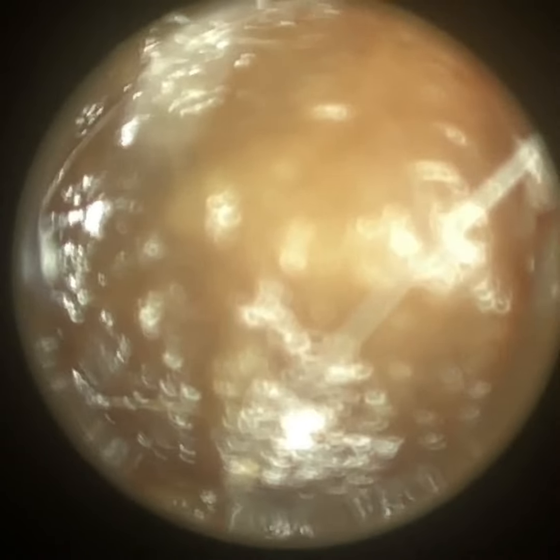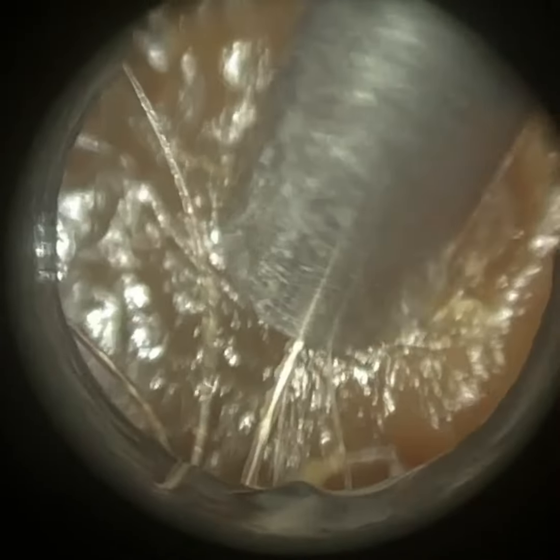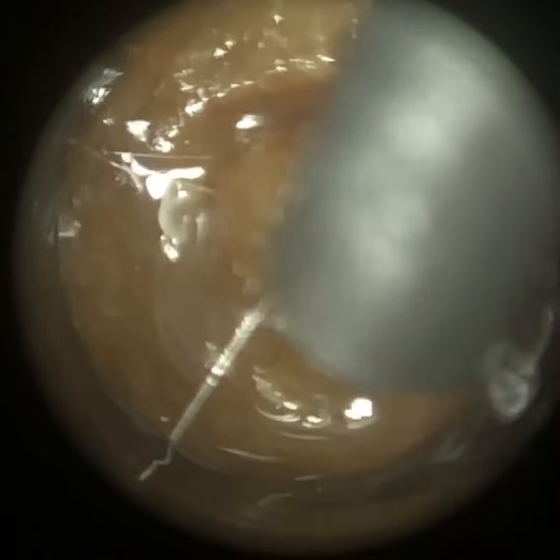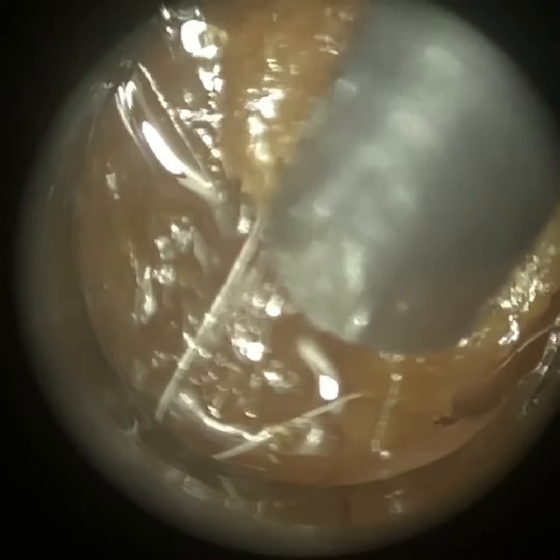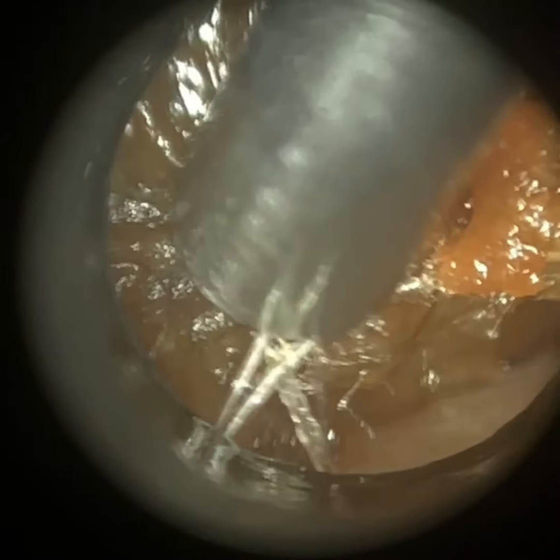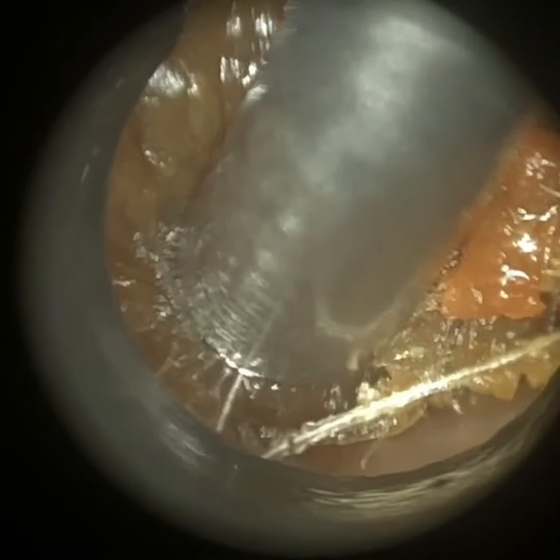This is the patient's right side — not too dissimilar. I've just reduced the brightness a little bit just to focus. Going to the floor of the ear canal — you generally find that the wax plug is adhered to the floor and to the posterior canal wall typically. So if you separate it in that region you help to mobilize the wax plug. I'm just following this wax plug around the perimeter of the canal; it's quite stubborn in this region.